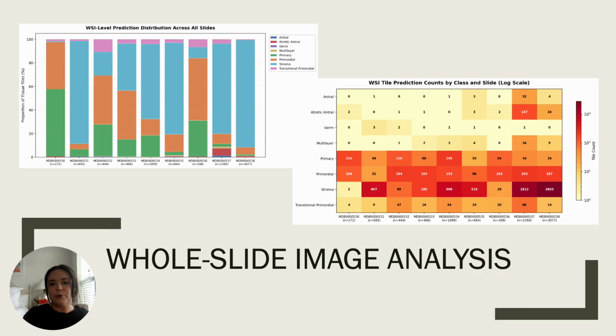The neonatal and the prepubertal slides have more diversity in their breakdown composition, which could be related to the varying ages that range from 1 day old to 180 days old, while both adult donors were recorded at 3 years old.